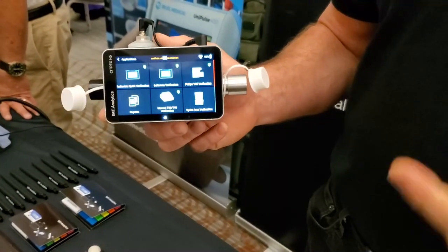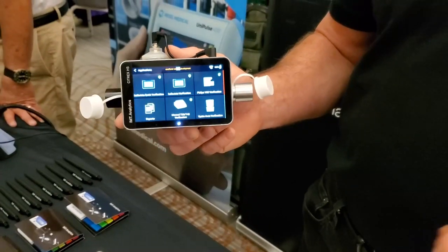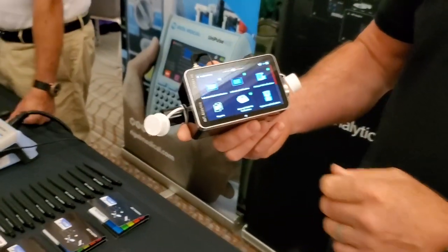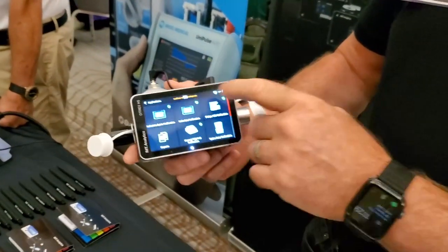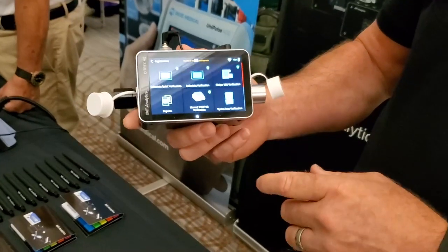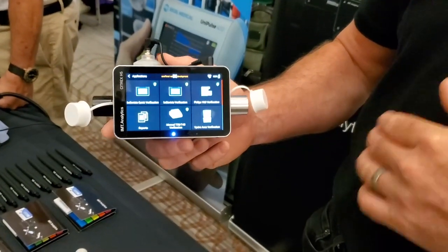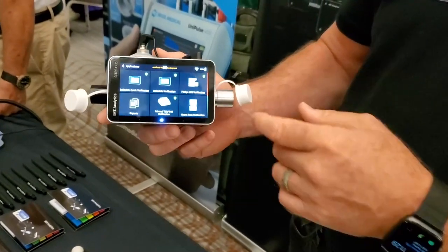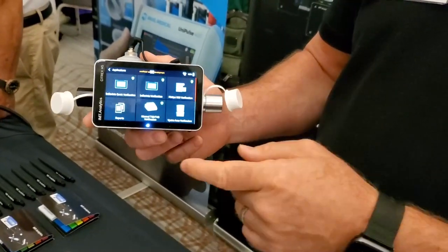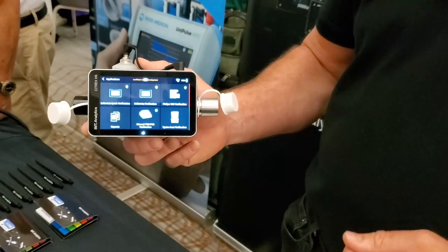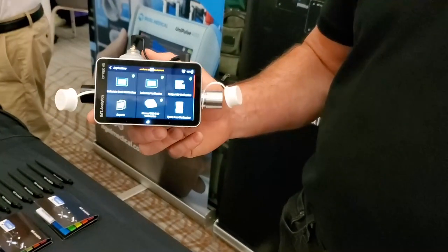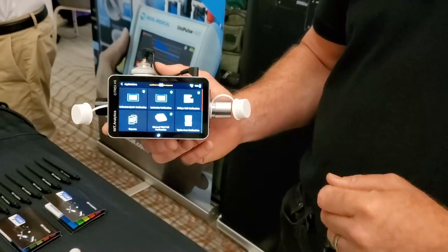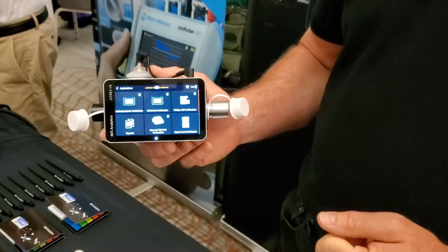You can actually set it to automatically go out and search for updates. You can do it daily, weekly, or monthly, or not at all. And that's all under the settings.